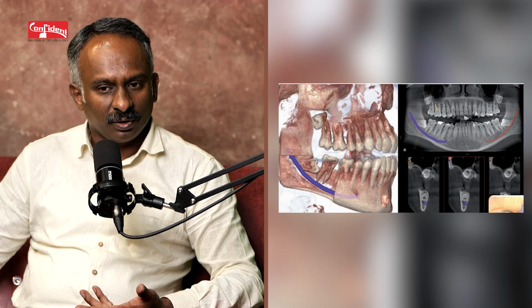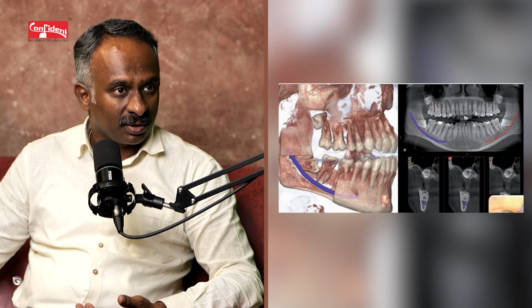In surgery, we can go for disimpactions and fracture assessment. In rehabilitation, most people nowadays are going for the rehabilitation of missing structures, especially post-COVID, where we tend to see osteomyelitis, and rehabilitation of structures like the eyes and maxilla is needed. CBCT can play a major role in understanding and assessing it.